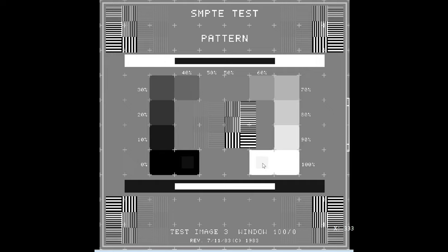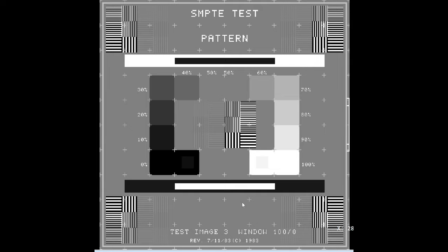And then over here, we're looking at the 95% patch that is within the 100% patch. So this is a look at high and low contrast to make sure that you can distinguish between very small changes in gray level.